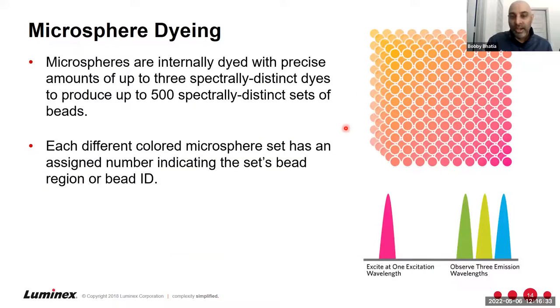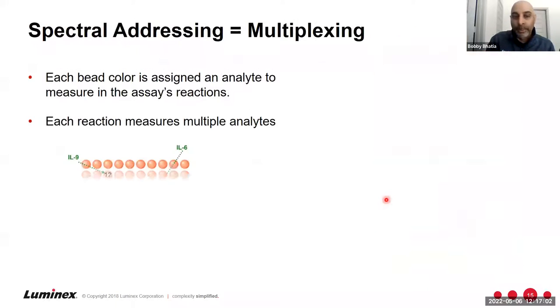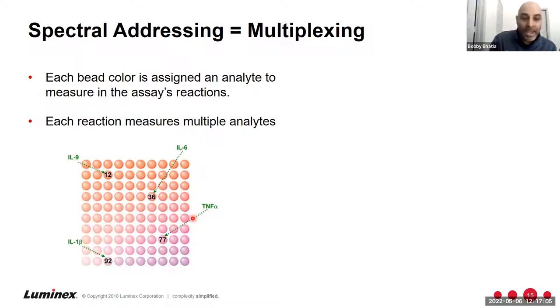So regarding the technology itself, the beads are multicolored with red and near-infrared dye ratios. And as I mentioned before, on the other instruments we have up to 500 different bead region targets. In other words, flexibility. So if you have 20 nucleic targets you're interested in, or 20 protein targets, every target has its own bead region or bead ID, and they're all mixed as a master mix. So for example, if you're working with cytokines and you're working with four different cytokines, when you purchase a kit, you'll get, let's say, four cytokines, and each of those has a color-coded bead that's connected to it.